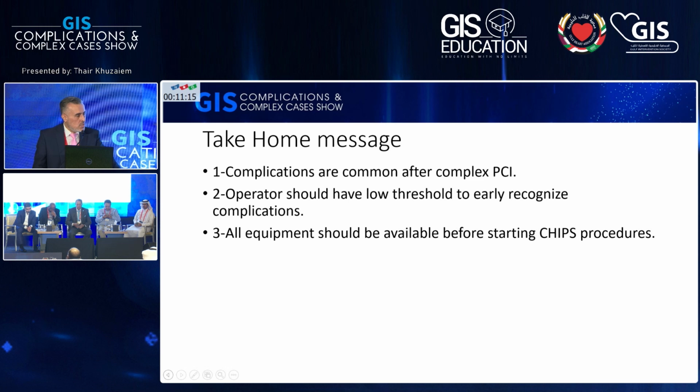So the take-home message: complications are common, particularly after complex PCI, and the operator should always have a low threshold to recognize a complication early. And as you all mentioned, all equipment should be available before starting any CHIP procedure.